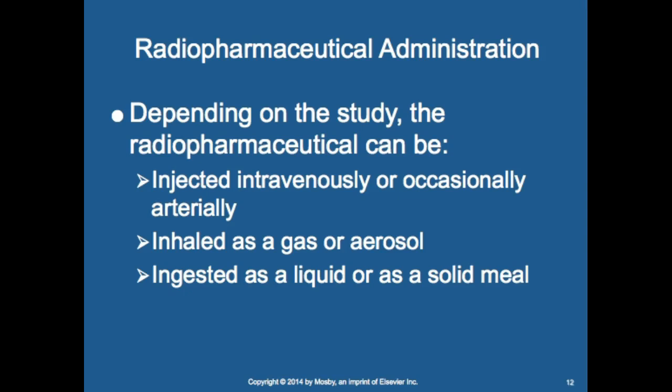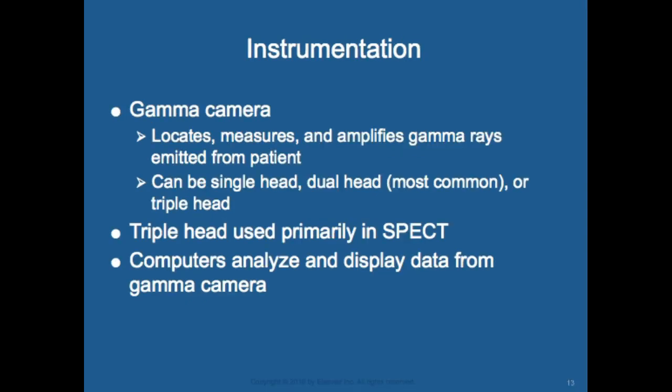So, depending on the study, the radiopharmaceutical can be injected intravenously or arterially. It can be inhaled as a gas or aerosol, or it can be ingested as a liquid or as a solid meal. So they'll actually put it in a sandwich for a patient.